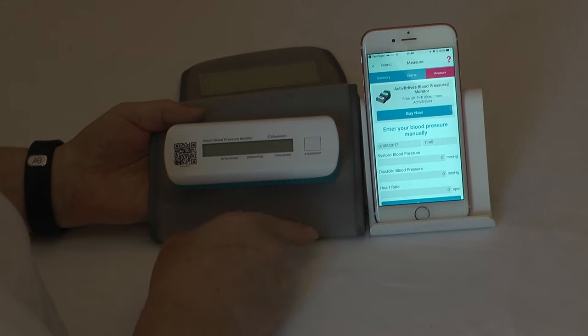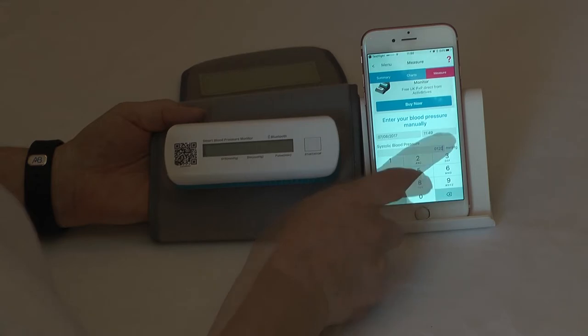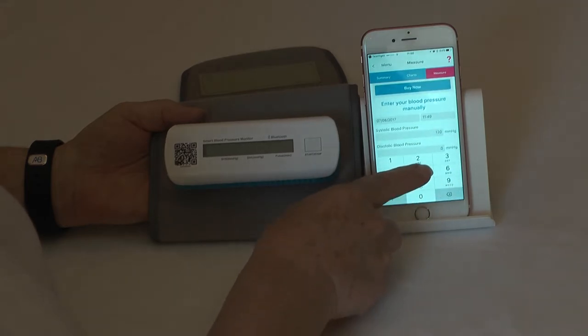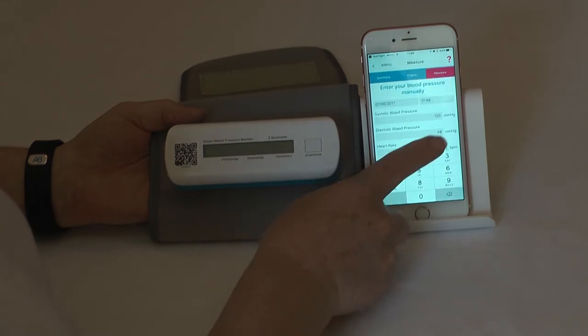You add in the systolic, diastolic, and heart rate. You can actually use this in order to add readings that you might take from another cuff that you might have at home.